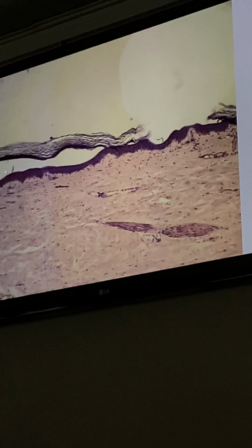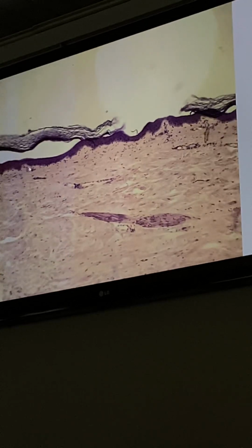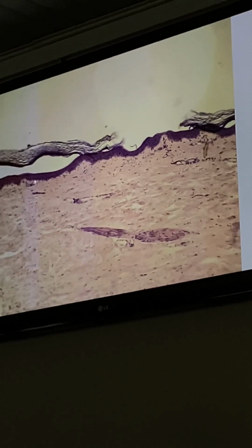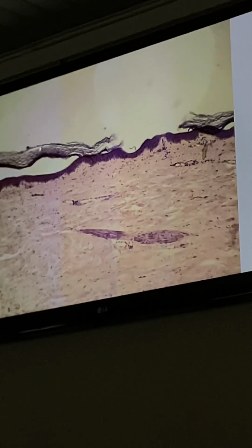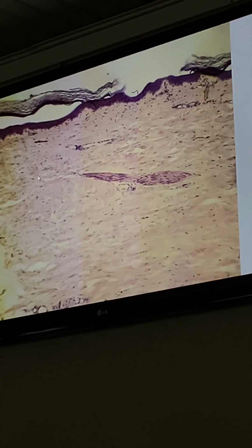This cavity occurred during preparation. In fact, it's a continuous layer, like this. You can imagine it's a continuous layer. Corneum, basale, spinosum, granulosum, stratum corneum. This is the epidermis layer, while the dermis layer also has the deep reticular layer.